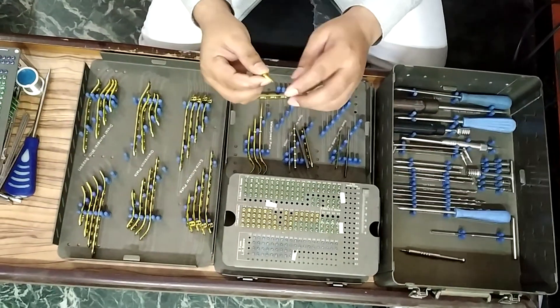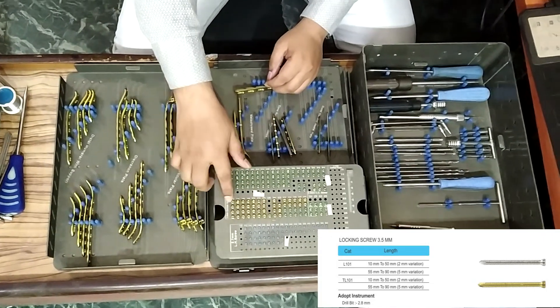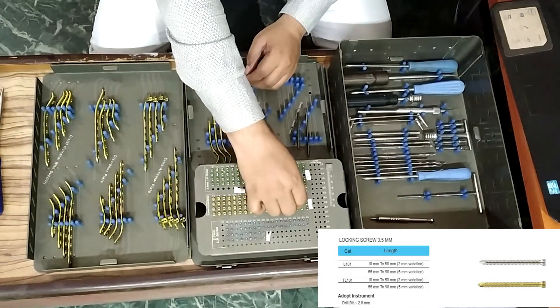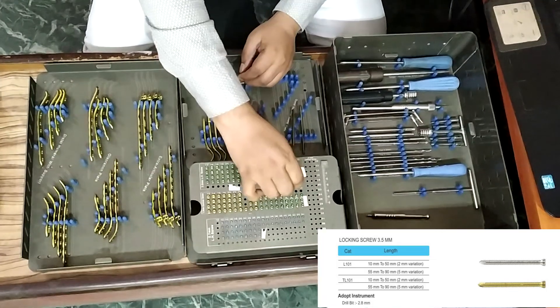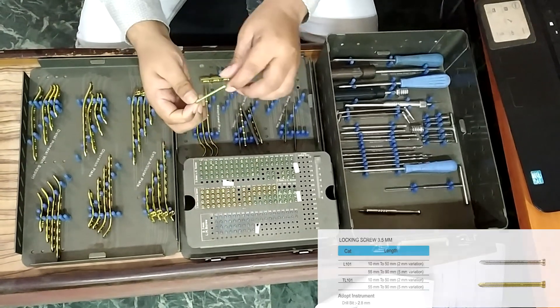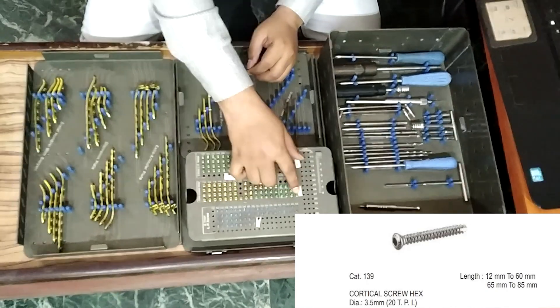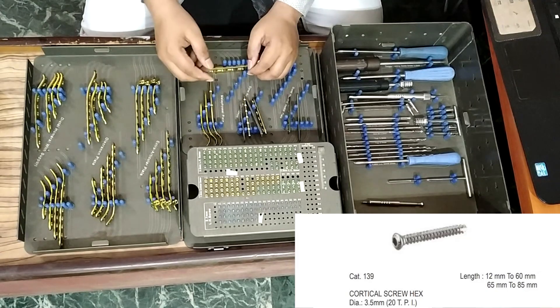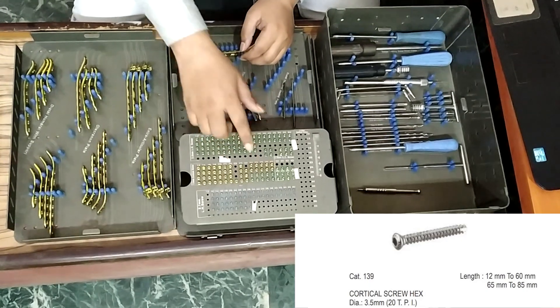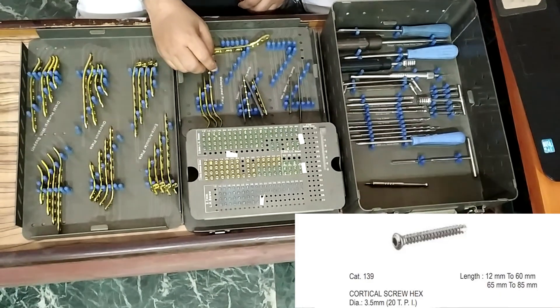Next, 3.5 mm locking screw, 12 mm to 28 mm, four pieces each; and 30 mm to 46 mm, two pieces each. The 2 mm gap will continue throughout. Also, 3.5 mm cortical screw, 12 mm to 28 mm, four pieces each, with a 2 mm gap maintained.